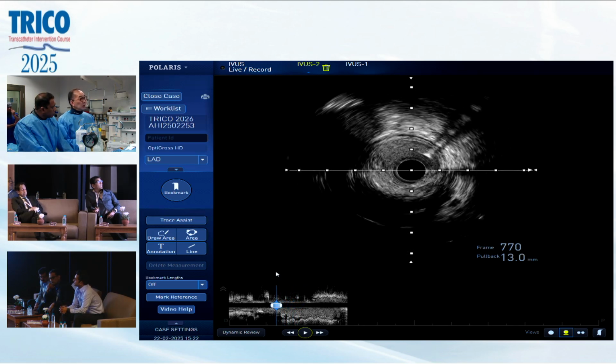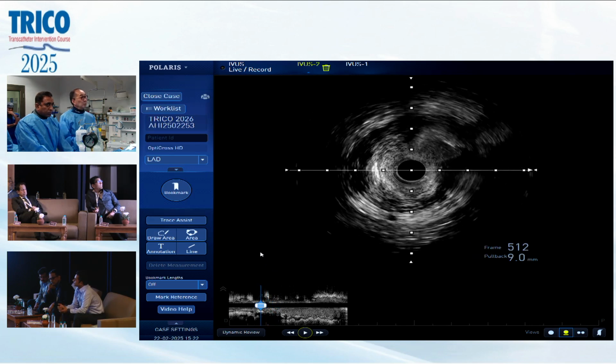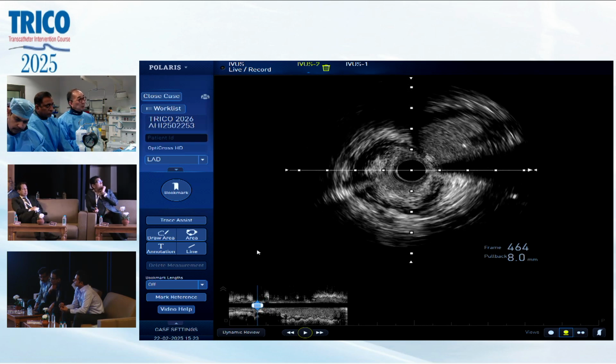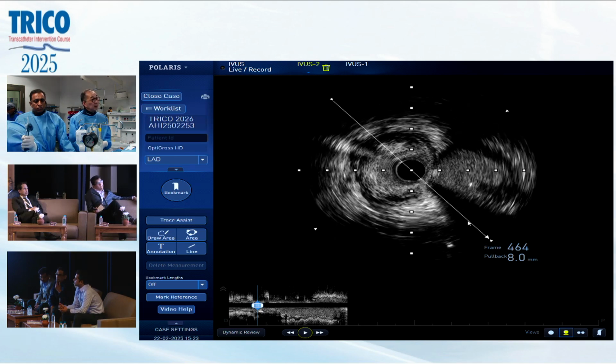In terms of the data, the provisional with a wire has much more data than the balloon. The balloon, I think, is very good when they are small vessels, maybe a 2.0 vessel, that's excellent to keep it open. But if we want to do a kissing later on, if we shift the carina, shift the plaque, then I think the jailed wire technique is much better.